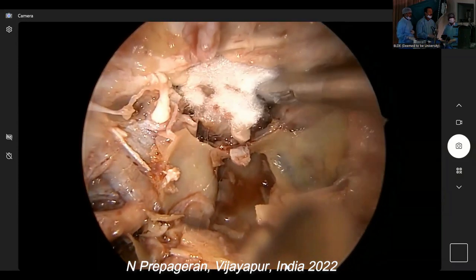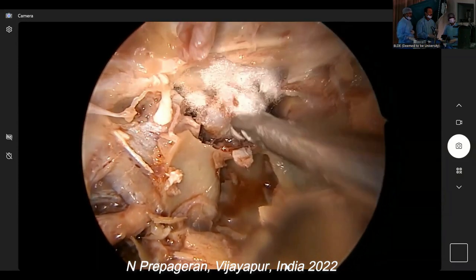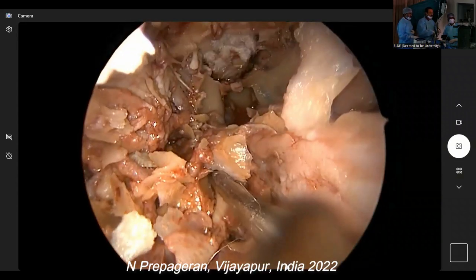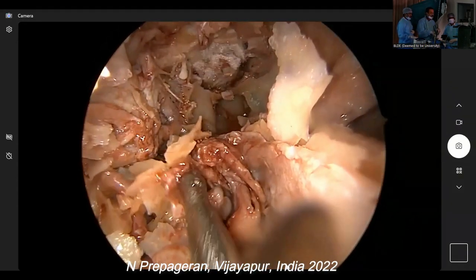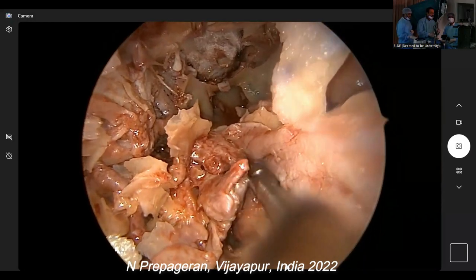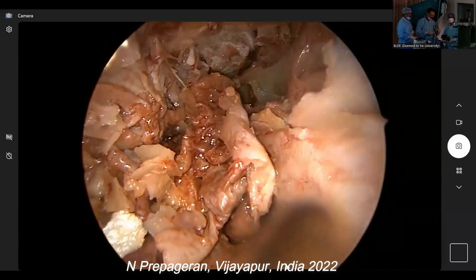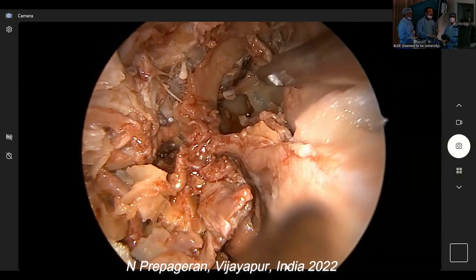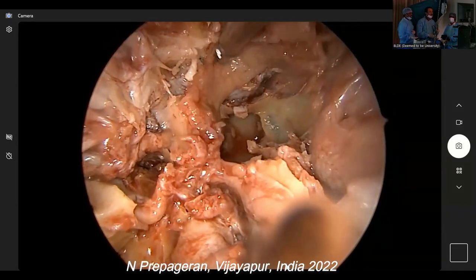Tuck it exactly along the edges of the dura. Mm-hmm. Where's our septal flap? Our flap is a bit small though, thanks to the previous workshop. I don't know whether the septal flap will be big enough or not. What do you think, Shashi? Big enough? Is enough? Yeah, yes. Okay.